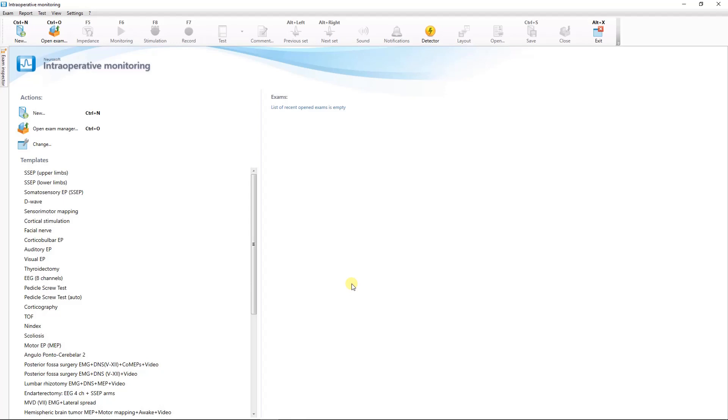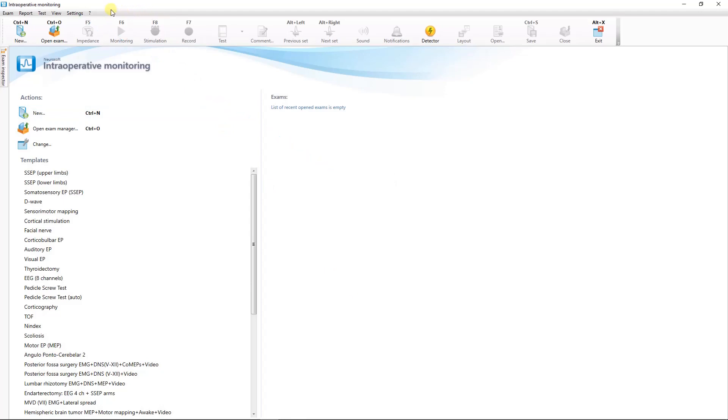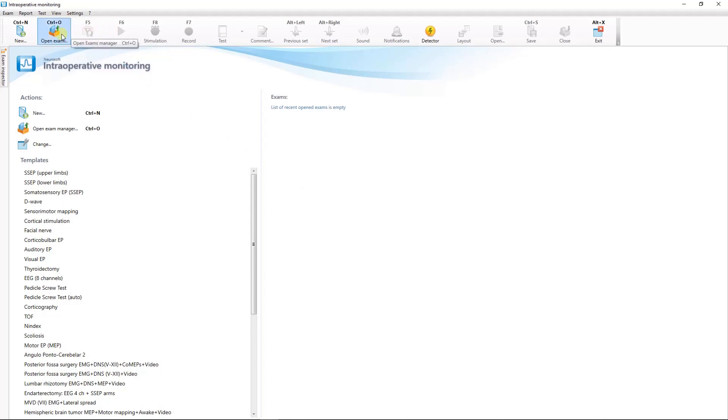On the screen you can see the main window of Nero IOM.net software. The menu bar is located at the top of the window. Below the menu bar is the toolbar to quick access the most frequently used commands.